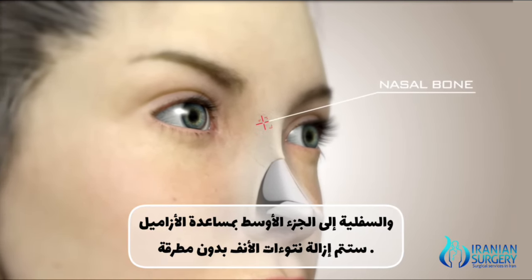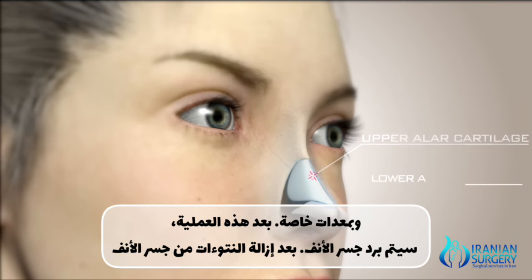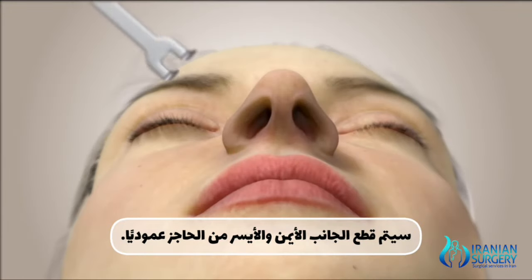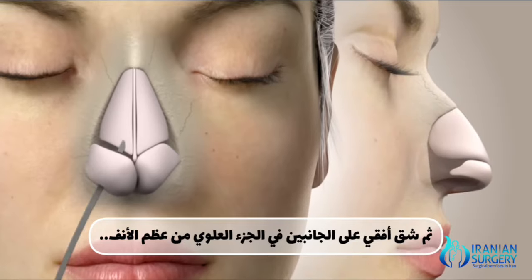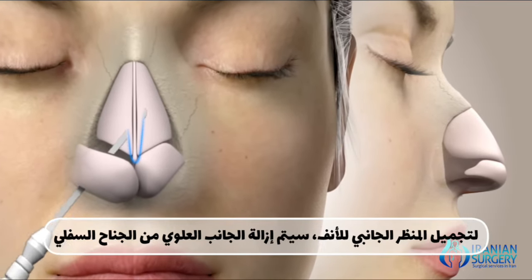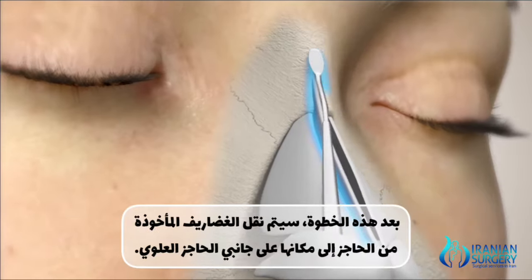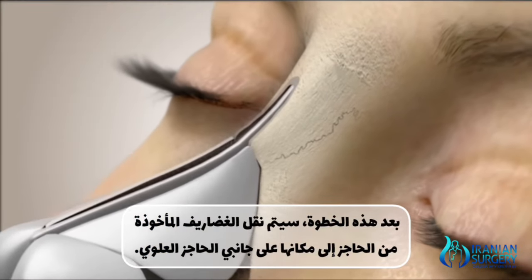Structure of nose contains nasal bone, upper alar cartilage, lower alar cartilage, and in the middle line, nasal septum. Under general anesthesia with intranasal chisels, upper and lower alar cartilages will be relocated in the middle part. Nasal hump will be removed without hammer by using special equipment. Following this process, nasal bridge will be rasped.